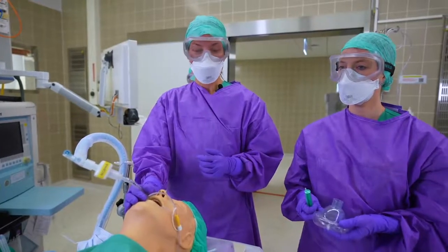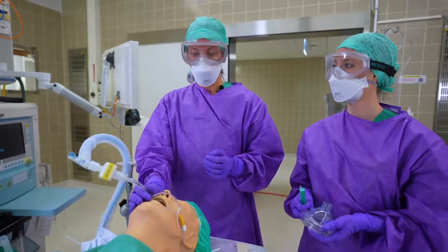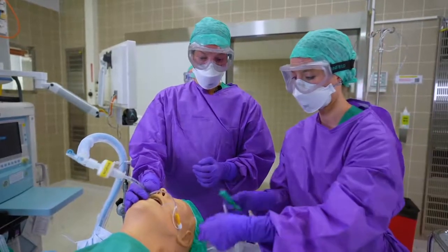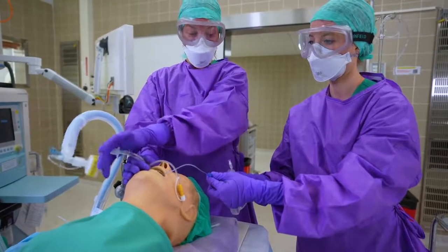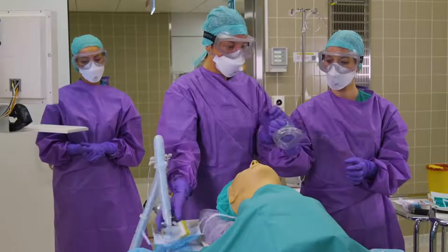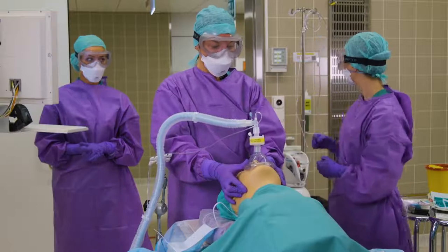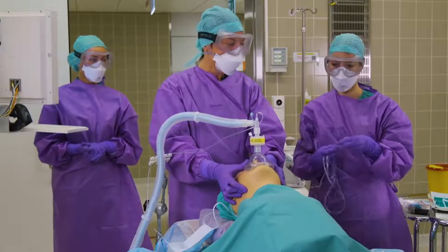It is important to avoid coughing when you extubate the patient. IV lidocaine or remifentanil come in handy. When you extubate, you are not utilizing positive pressure, but rather you are deflating the cuff and pulling the tube. We dispose of the tube right away and oxygenate the patient with a tight-fitting mask. Once the patient is adequately breathing, we are utilizing nasal prongs for transport.